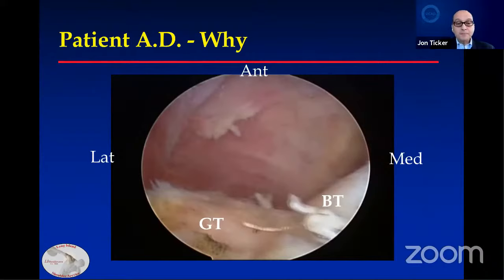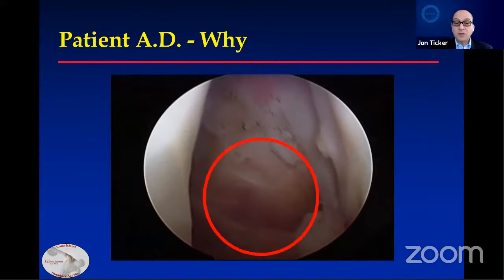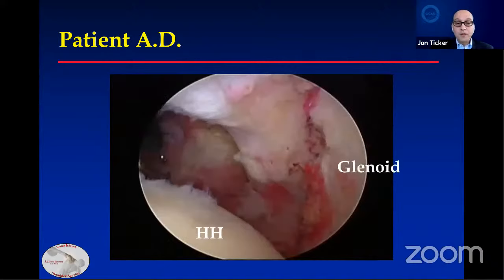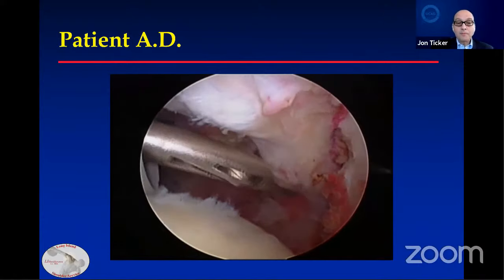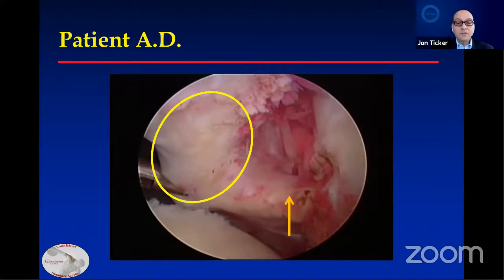The video of the same patient: you see the greater tuberosity and the biceps tendon. Going from lateral to medial with the arthroscope, the dislocated biceps — it can dislocate because there's nothing here. The subscapularis is torn and retracted more medially. We then go and try to identify that, place an instrument through a lateral portal, and grab on it. Now we can see the rolled edge of the subscapularis and the confluence connecting the supraspinatus with the subscapularis, called the comma tissue — originally described as a portion of the superior glenohumeral ligament, but also including a portion of the roof over the biceps.